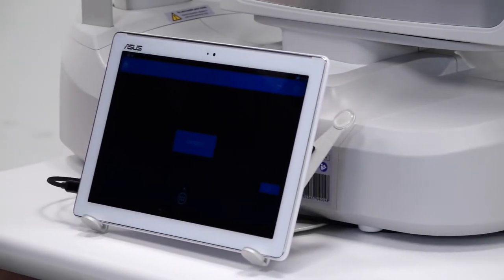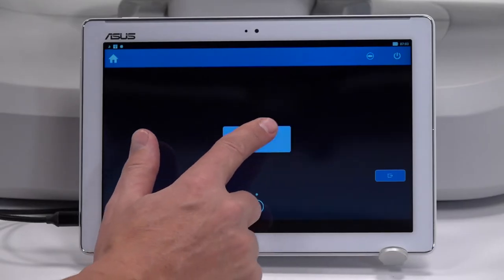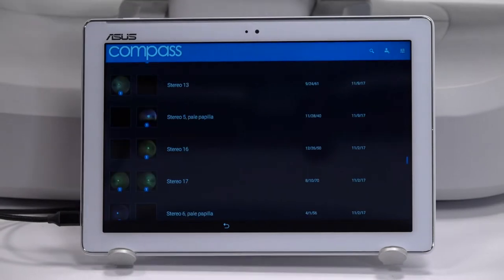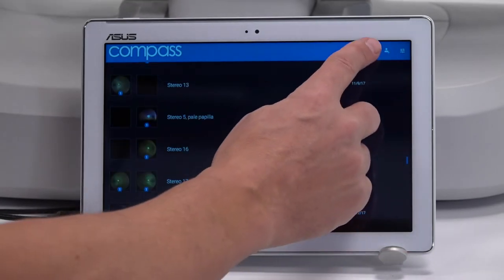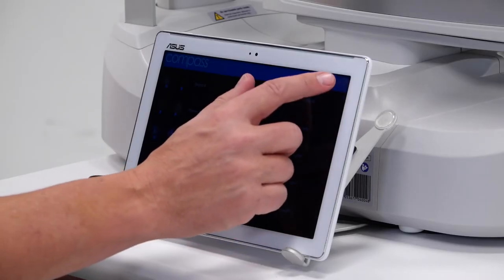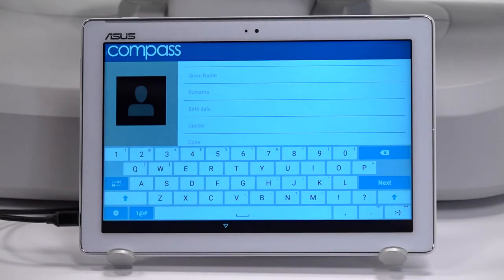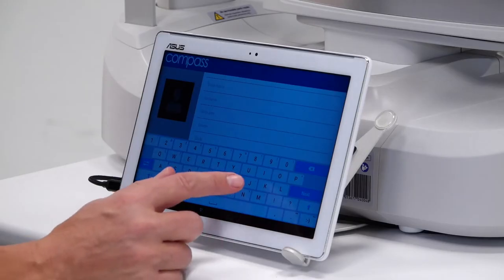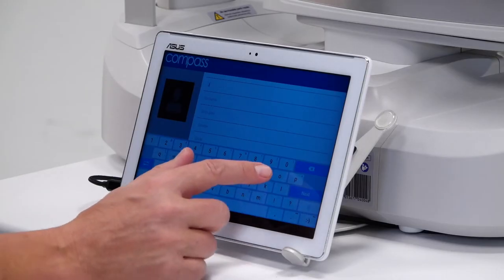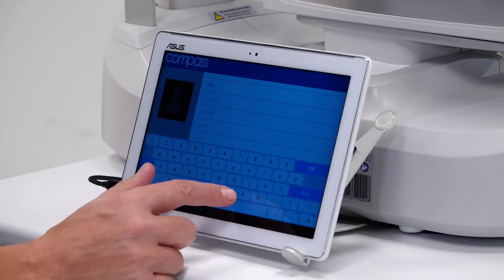Press the compass button to enter the patient list. Either search for a patient by pressing the search icon, or enter a new patient by pressing the new patient icon in the top right corner of the display.